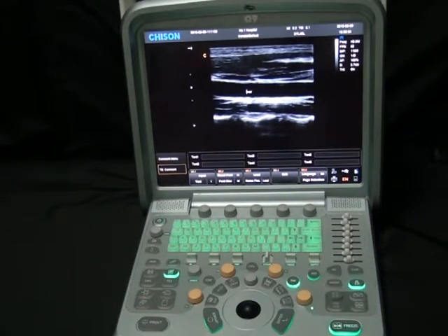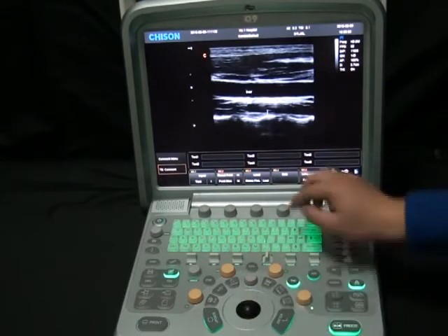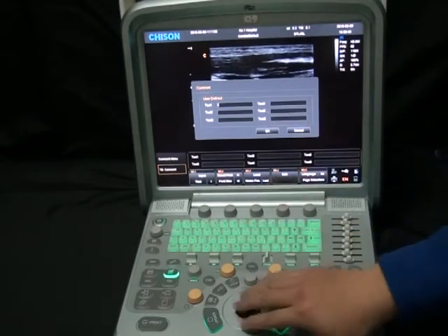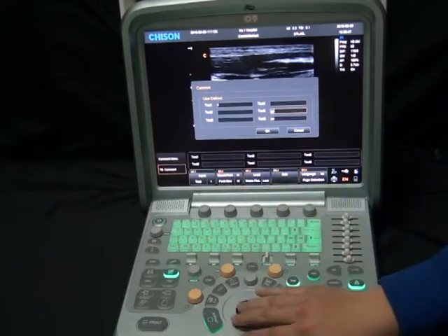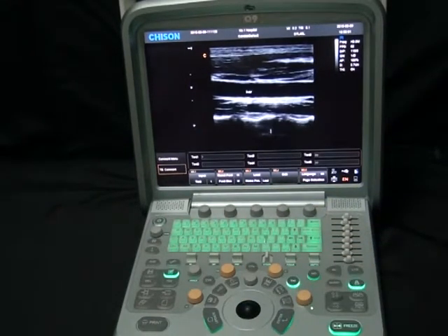We can also add our own quick comments. Here at number 4, we click Edit, and it will allow me to add custom comments that would come down right here for quick use. You would enter it here. Click OK. So if you would want to add that, we'll use this input.